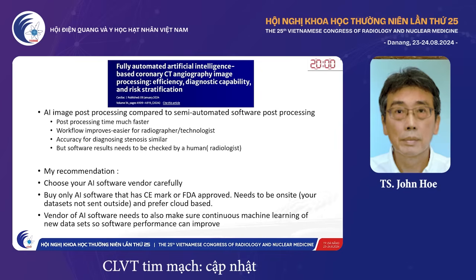My recommendation is choose your AI software vendor carefully, because there are many software vendors out there trying to sell you software. Buy only AI software that has CE mark or FDA approval, needs to be on site. Your data set should not be sent outside your hospital and should be cloud-based. Also, the vendor of the AI software needs to make sure that they're continually improving and doing more machine learning of new data sets so the software can improve.